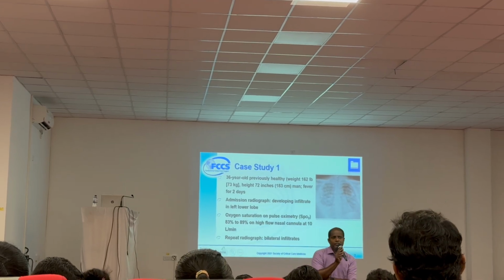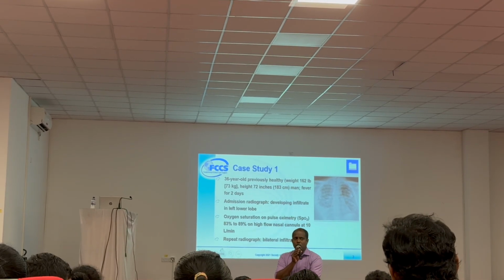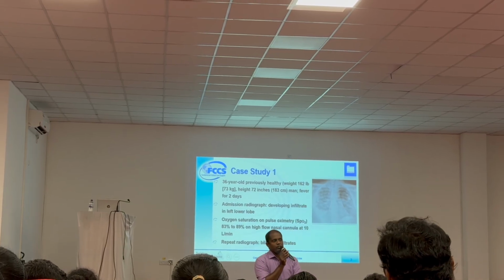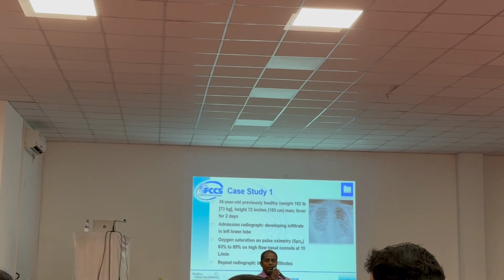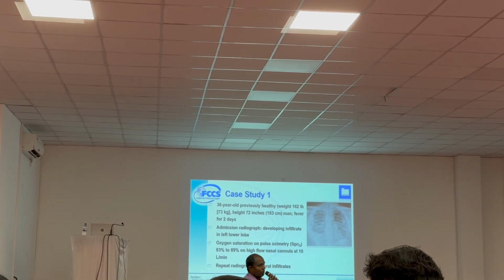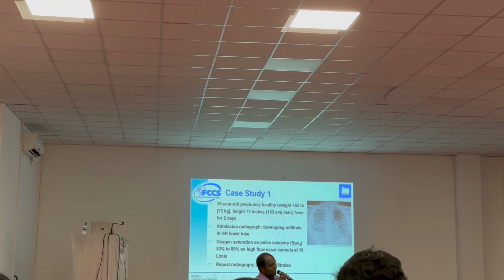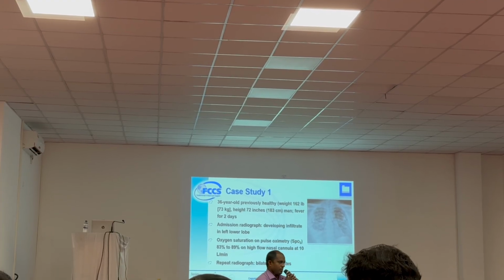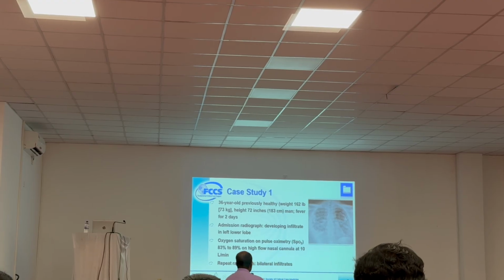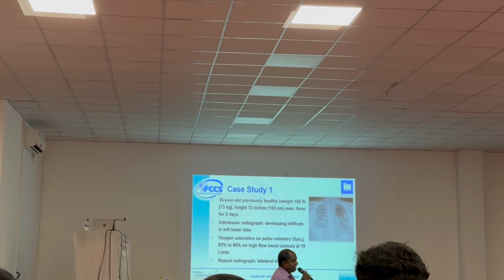So what will happen when you prescribe like this? Oxygenation starts to improve, but CO2 may be stuck within. But we never look after the CO2 in case of severe ARDS. Always we are looking at the pH. That's the first thing. Second thing is ventilating an asthma patient.